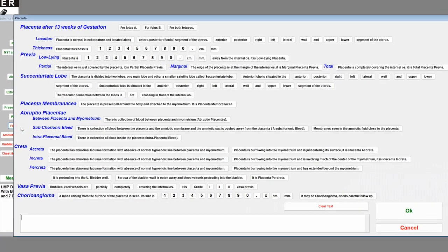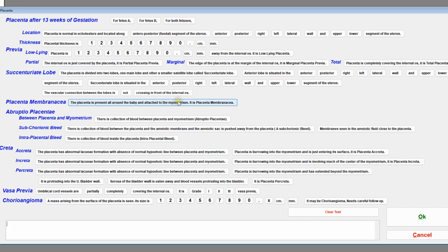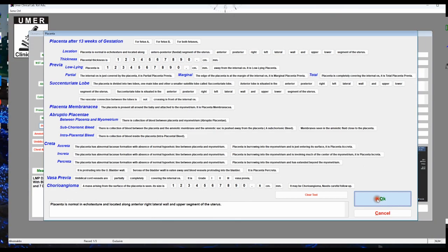Click 'Placenta'. All possible placenta locations and abnormalities are listed — abruption, placenta accreta, vasa previa, chorionangioma, and more. Just click the text you want to include. Suppose the placenta is normal in echotexture, located along the anterior right lateral wall and upper segment of the uterus — select accordingly and click OK.